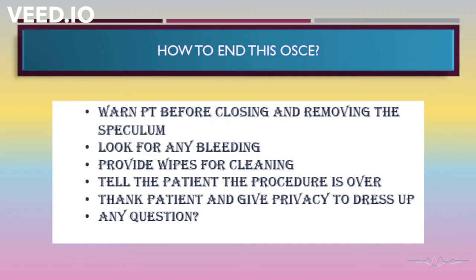How would you end this OSCE? Warn the patient before closing the speculum and removing the speculum. Look for any bleeding. Provide wipes for cleaning and tell the patient that the procedure is over. Thank the patient and give the patient privacy to dress up.